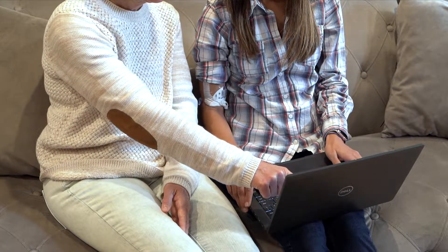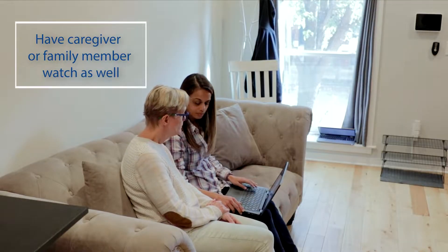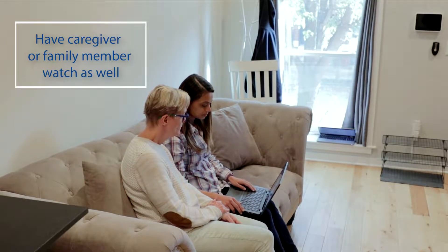Please watch this video as many times as you need. If you have a caregiver or family member assisting you, please have them watch this as well.